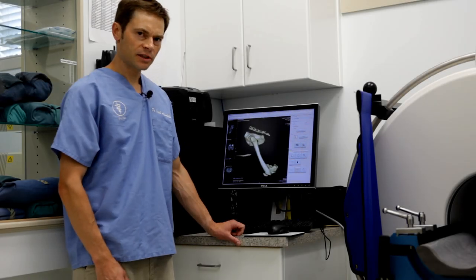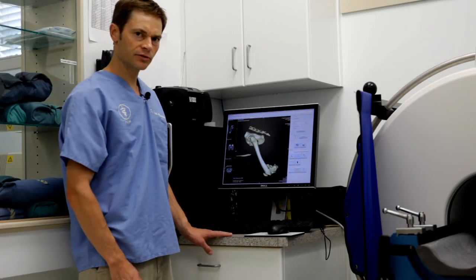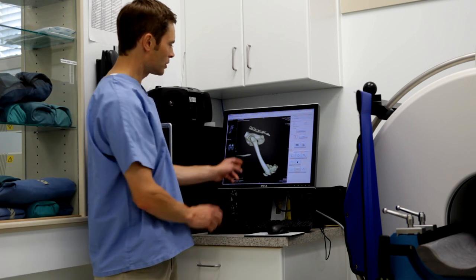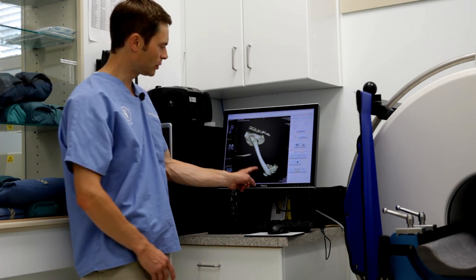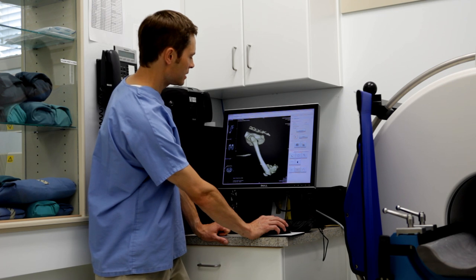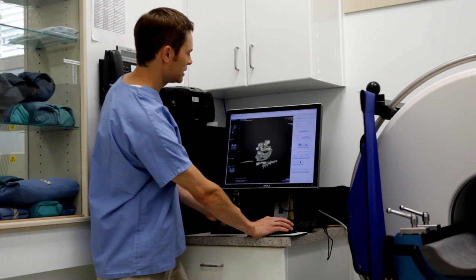This is a fractured leg that we were looking at here a few days ago. You can see the pelvis over here and the femur, and in this case we can evaluate the fracture here.